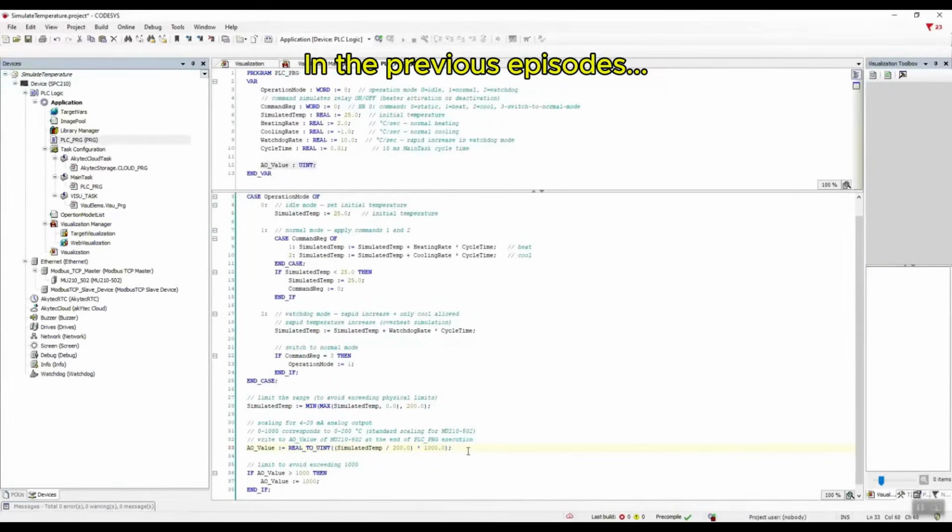With this signal, we can encode the temperature for our range from 0 to 200 degrees with an accuracy of 0.2 degrees Celsius. But this level of accuracy for our range can actually be improved.